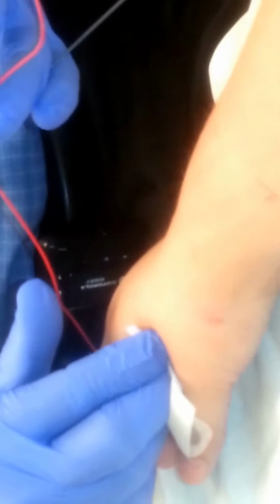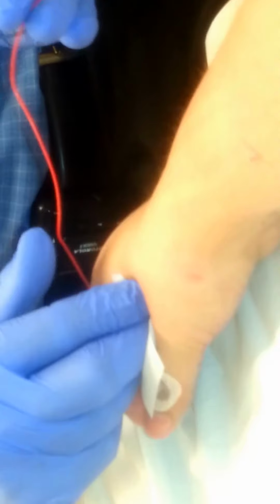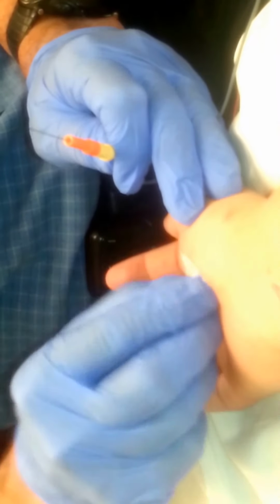You're killing me, Smalls. This one is a painful one. Please no. This is the one we were talking about for the carpal tunnel. We've now worked our way around it. We don't see any slowing through the carpal tunnel. But sometimes, because what we're looking at is your nerve function, and your nerves are just like this wire, insulation on the outside, and living fibers on the inside, right? Just like the copper fibers. And so we know the insulation's good. It's just flying from your neck all the way down to your fingers. And the inner fibers are good from the shoulder muscles all the way down to here. So we only have this one muscle left to try, and that's the abductor pollicis brevis muscle. And this gets its nerve supply from the median nerve through the carpal tunnel.